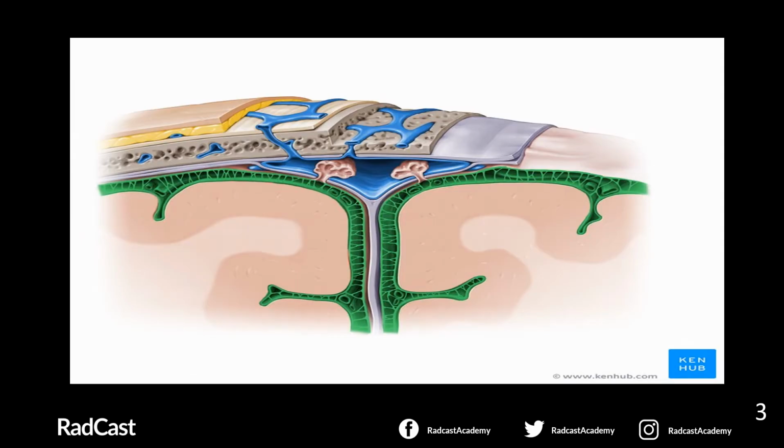After we discussed what is arachnoid matter, so what is the subarachnoid space? The subarachnoid space is the space between the arachnoid membrane and the pia matter. It contains connective tissue trabeculae, cerebrospinal fluid, and branches of the brain vessels. You can see here there are two green lines close to each other. The outer one is representing the arachnoid matter and the inner one is representing the pia matter.